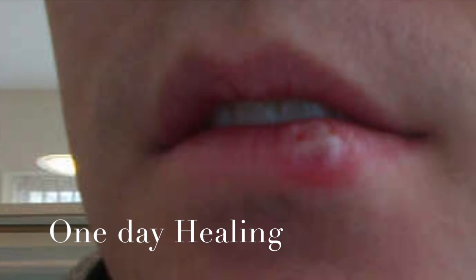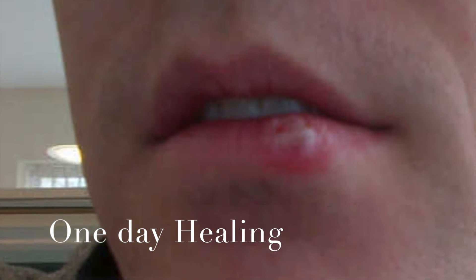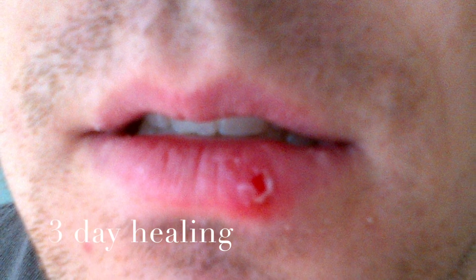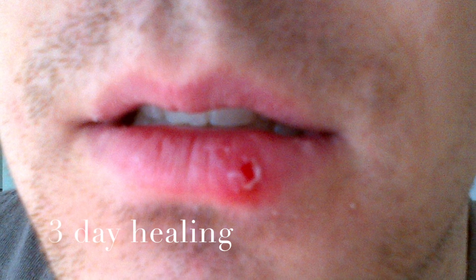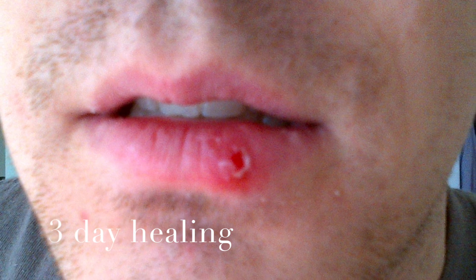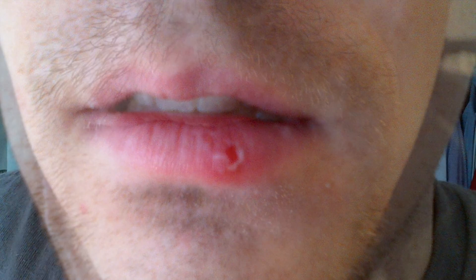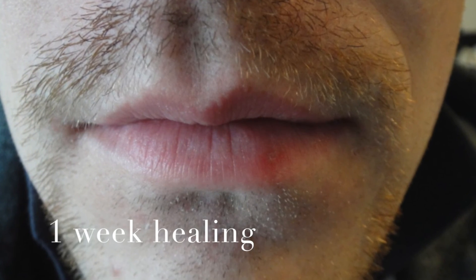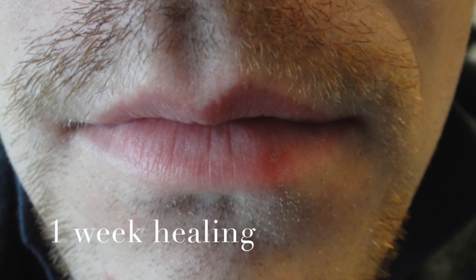We can now see the post-operative view with one day of healing, showing the lesion has a slightly whitish area. After three days, we can see that there is almost complete healing occurring. Here is the complete one-week healing of the lesion.